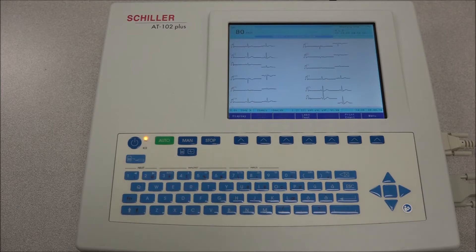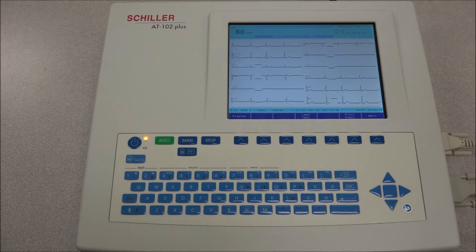After 10 seconds, the data is analyzed and the results can be displayed, printed, saved, or transmitted.